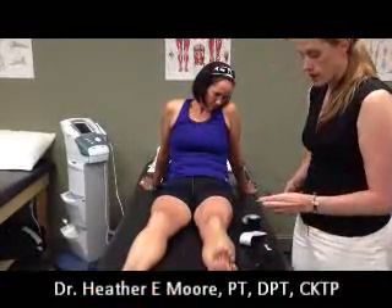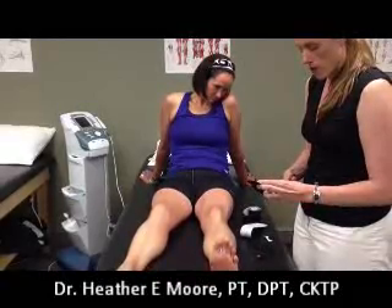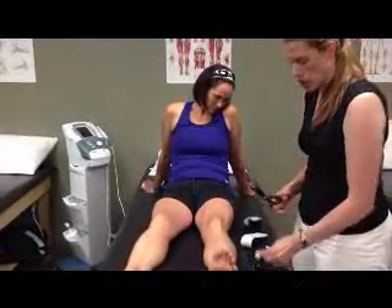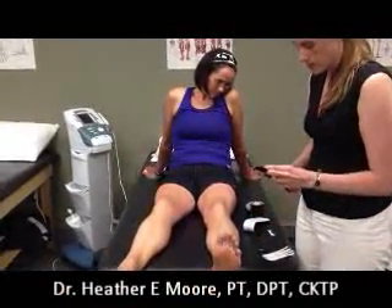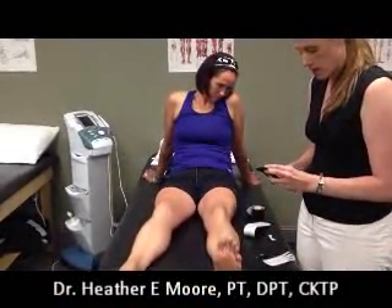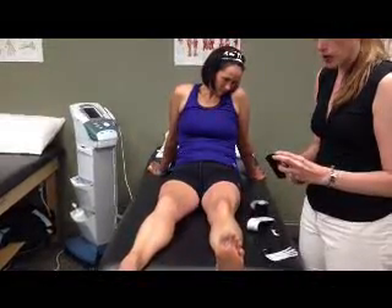With your fan cuts, you want to make four or five finger-like projections, leaving a solid base. If there's a pattern on the back of the type of tape you're using, you don't have to follow that.